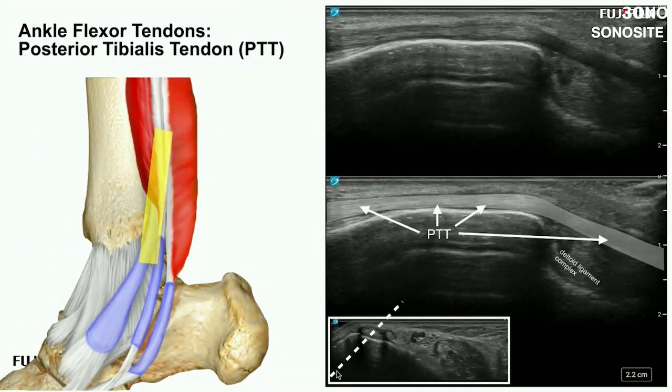Notice the angle the transducer should go. I don't want you to go 90 degrees to the skin here. I want you to lean the probe handle towards the Achilles, and that will allow you this nice bony backboard of reference. If you only take a 90-degree slice here, even though it looks like you're going to have a nice bony reference, because of the shape of the tibia, you're only going to catch part of the malleolus, and the rest of the tendon will be floating out in soft tissues. So it's not much of a reference point of the bony acoustic landmarks in the area.